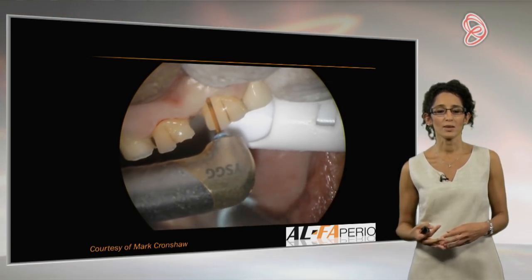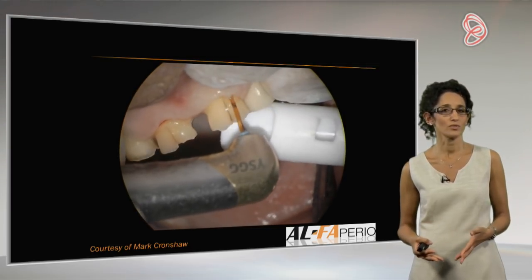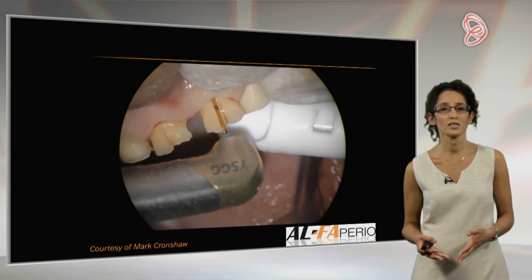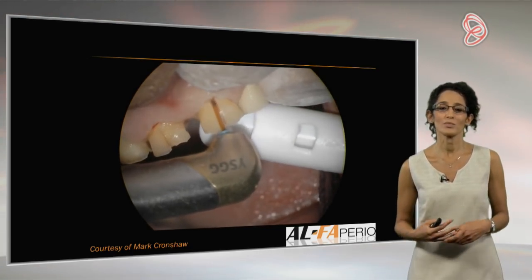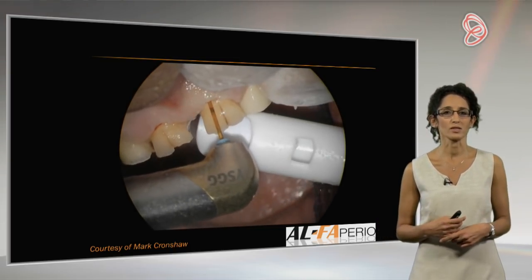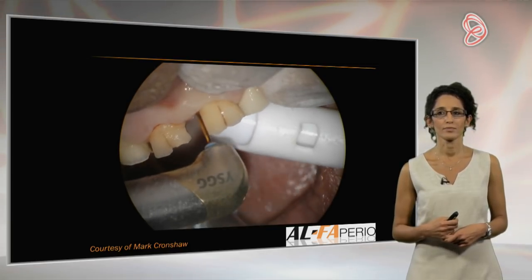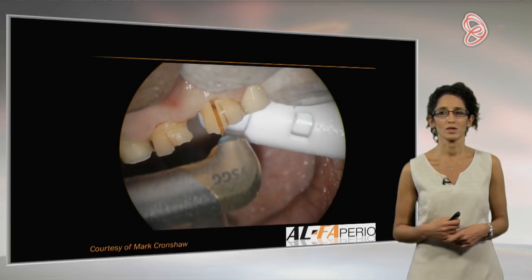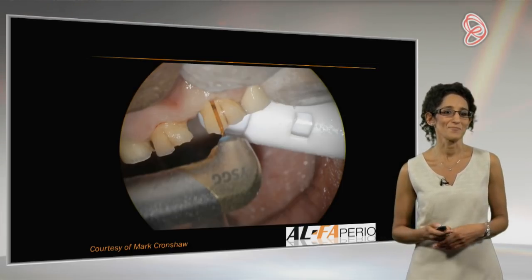And in terms of timing, I still book off the same amount of time as if I was raising a flap. So it's true I don't have to put sutures in, but to be honest, it probably takes me an equivalent time. So I'm doing it for the other advantages that we've talked about. So there we go, he's just going in and finishing off that bone removal. So as simple as that.